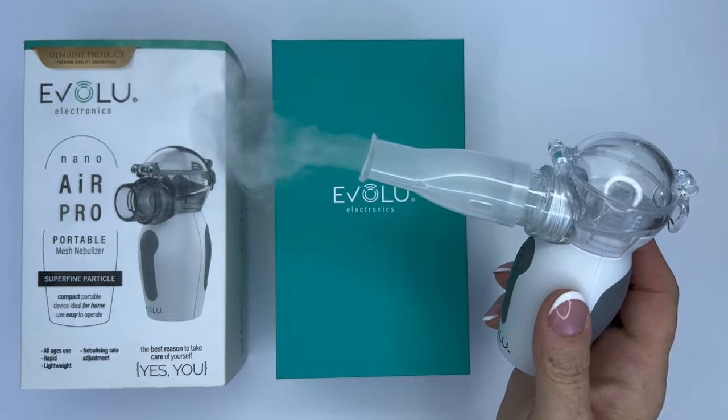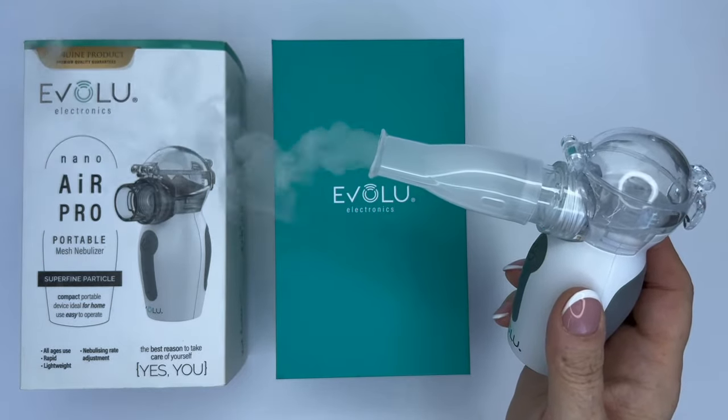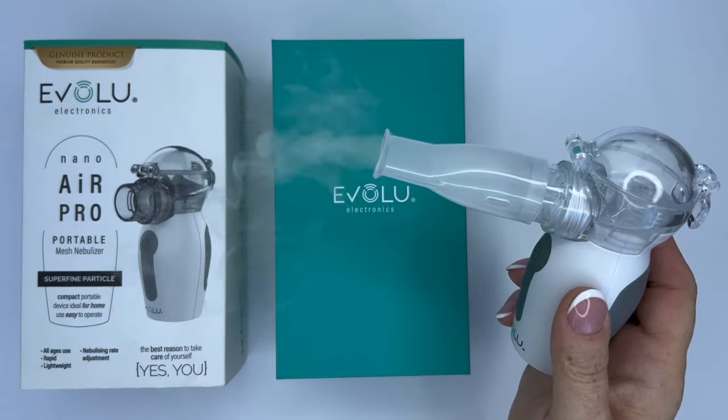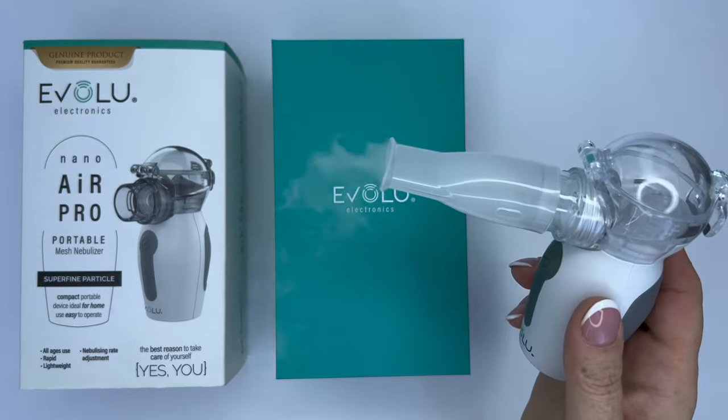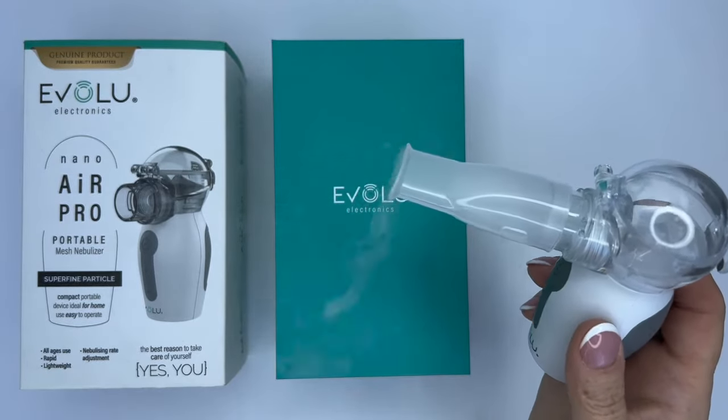The inhaler performs the inhalation process by converting the medicine into a light mist that reaches the lower respiratory tract. Regardless of the size of the device, in terms of functionality, it is as effective as any other inhaler.